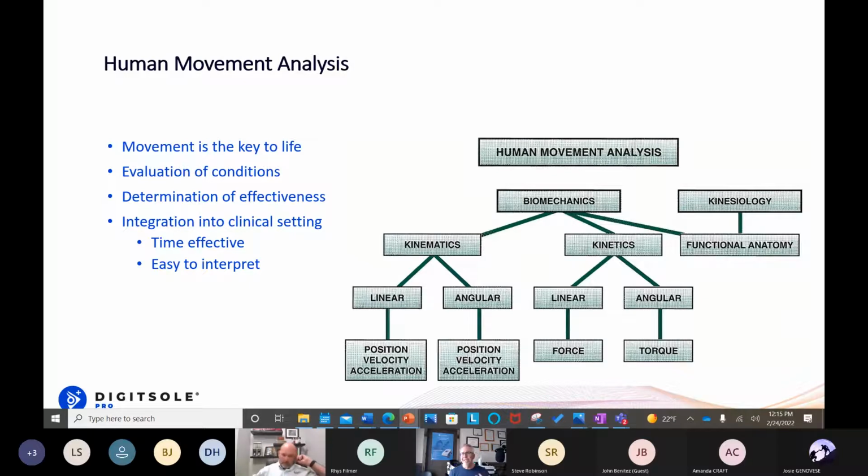The other thing that assessment allows us to do is determine the effectiveness of whatever it is that we're doing in the clinic, right? If I'm doing these exercises, if I'm doing this particular physical agent, or what have I given the patient to do at home, is it working, right? Because we have these outcomes-based data categories to determine whether or not something is working, and even certain normative data that allows us to look at the level at which they've achieved. And sometimes we refer to that as this maximal medical benefit.